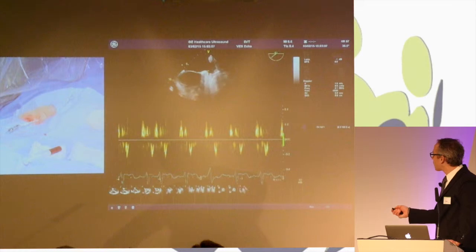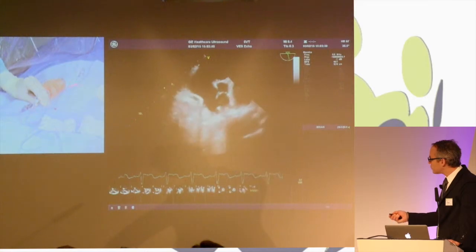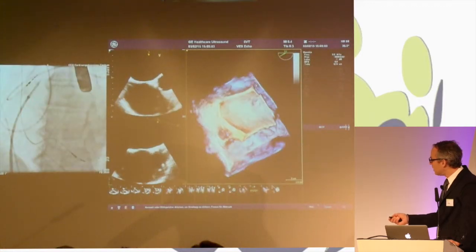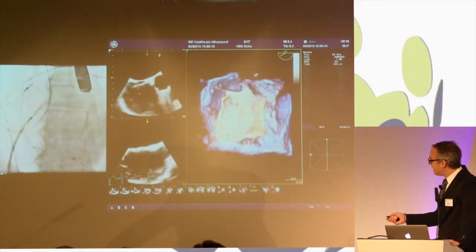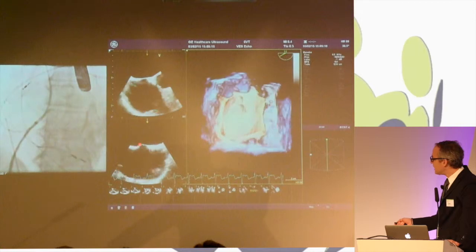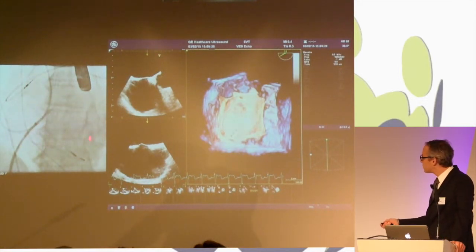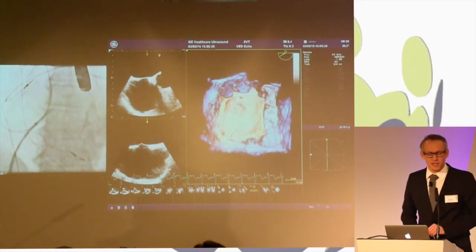Then, after getting a first idea of the left atrial appendage anatomy, we're starting the transseptal puncture. You see an SL1 sheath in place, a Brockenbrough needle pointing at 5 o'clock, and then we're starting the descent in the fluoro, with a long bicaval view on echo and a short axis view on echo in order to see a tenting at the interatrial septum. And this is where we stopped because we felt this might be the first chance for a transseptal stick.